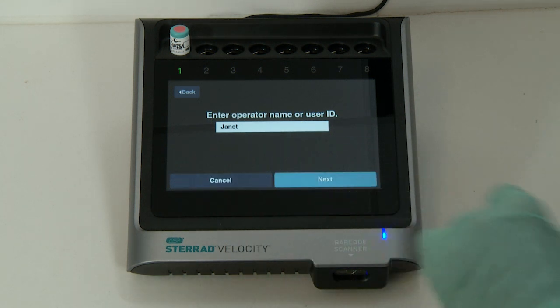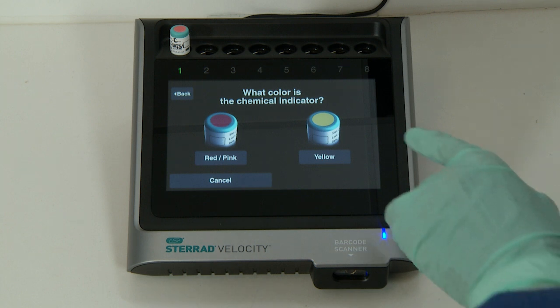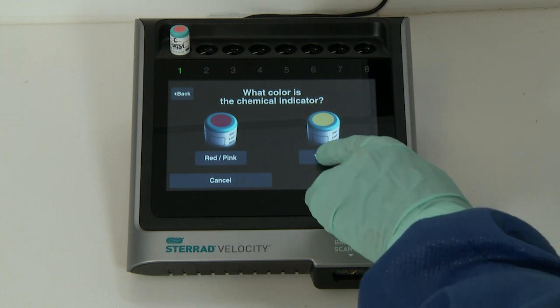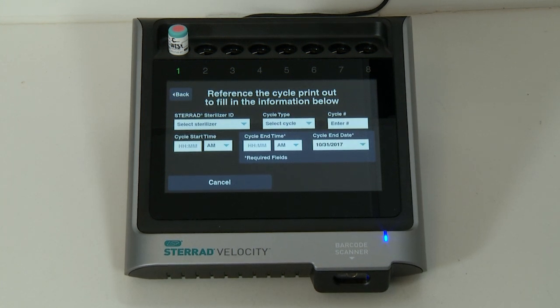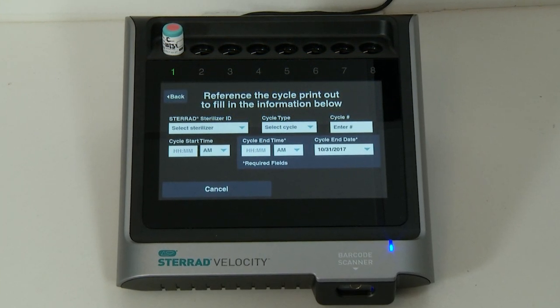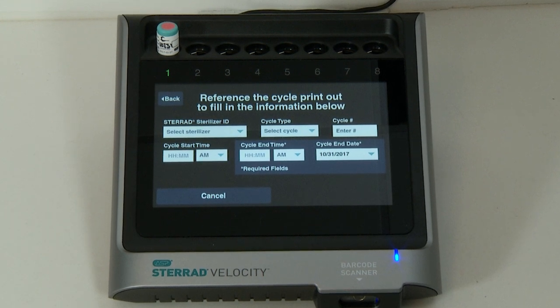You will be prompted to inspect the chemical indicator on the top of the cap for color change from red-pink to yellow, which confirms the BI has been exposed to hydrogen peroxide. Next, complete the requested information fields before touching Next. This information can be found on the cycle printout from the corresponding STERAD sterilizer.